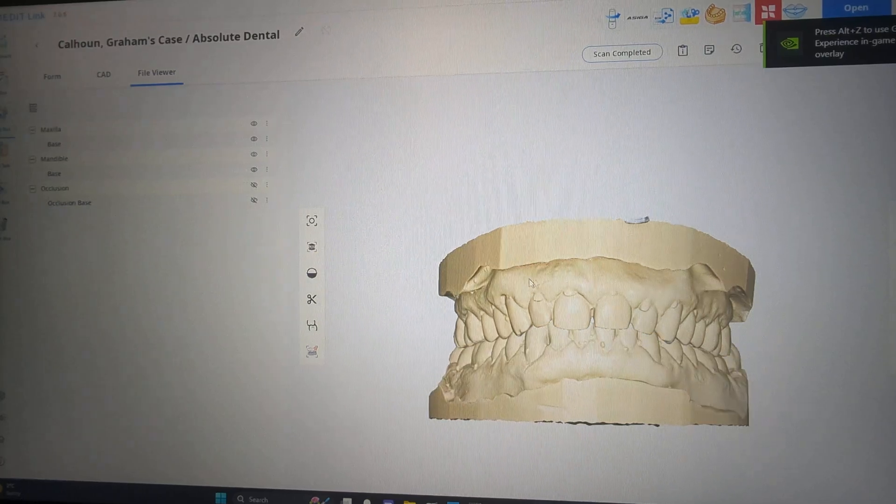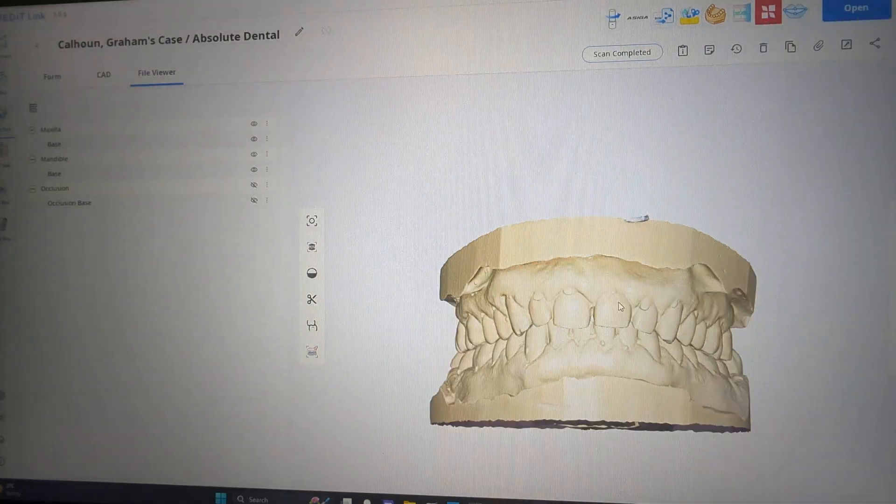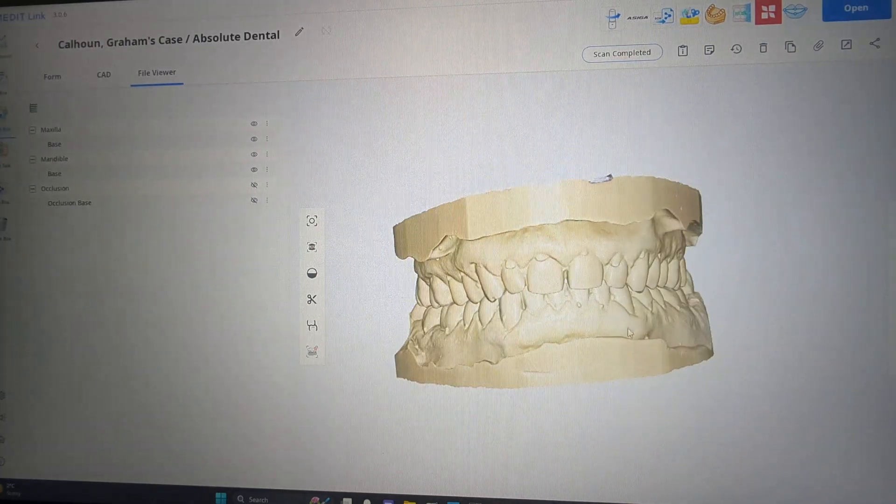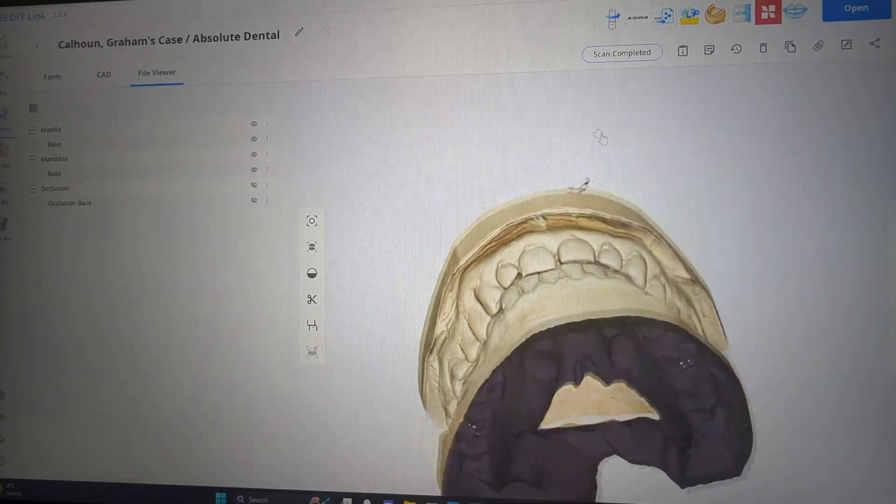Hello fellow friends, this is the senior lab guy, aka Paul Imperius. I've got a case here we're working on — I need to make a night guard for this patient.